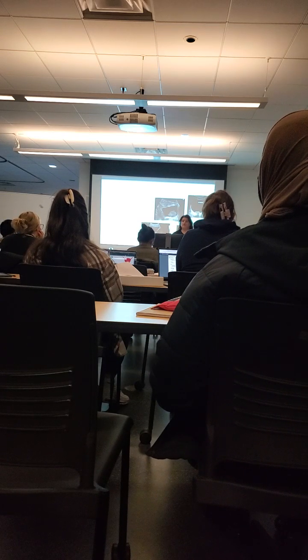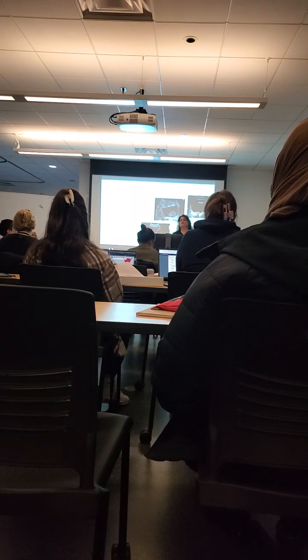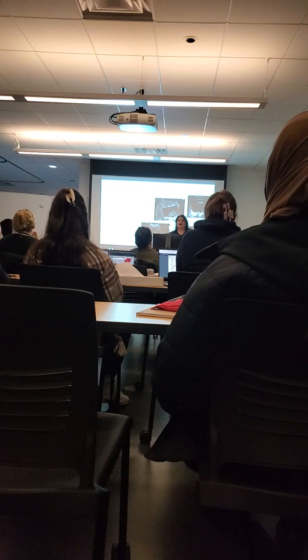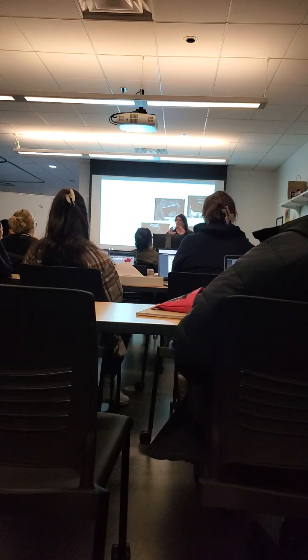So we're looking at the echogenicity. Is it anechoic fluid or are there echogenic debris, low-level echoes in there? The sludge in the bladder, is that urine stasis? It could be, or an infection. If urine can't go out, that's a really good point, Connor. If urine cannot get out of that urethra because maybe there's a stone stuck and it can't get out, then it's just sitting in that bladder. And if it sits in that bladder, it's just gonna get gross. I mean, think about it, right?